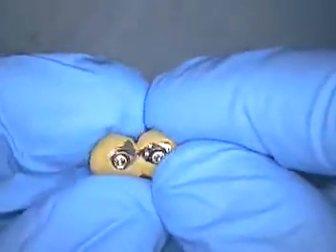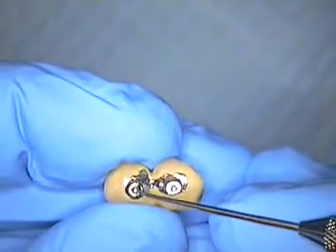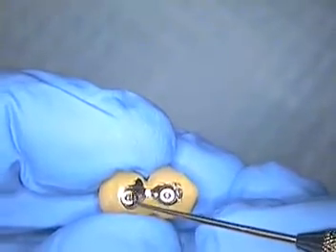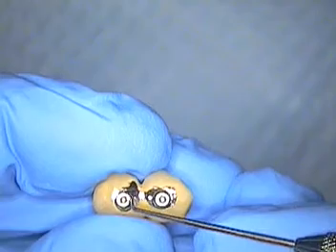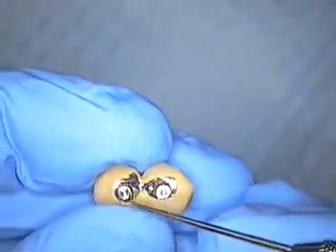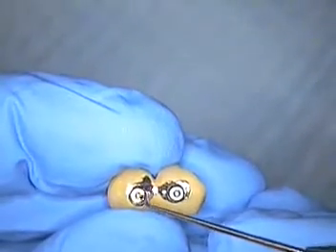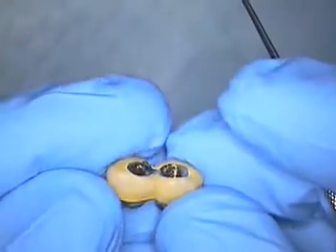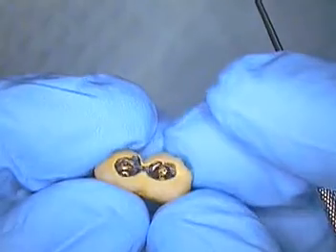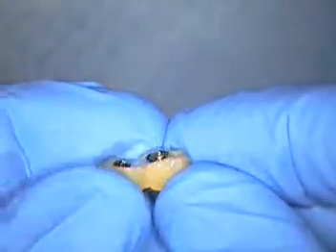And different ones, if the labs did everything correct internally on the casting, they should bottom out pretty nicely. If there's anything down inside the UCLA abutment, if they didn't clean that out or ream it out enough, sometimes these screws are a little offset. So it puts tension on the threads and then eventually it unscrews itself. So that's another small pitfall, but it's something that the lab needs to address. And also the dentist needs to fit check the case.